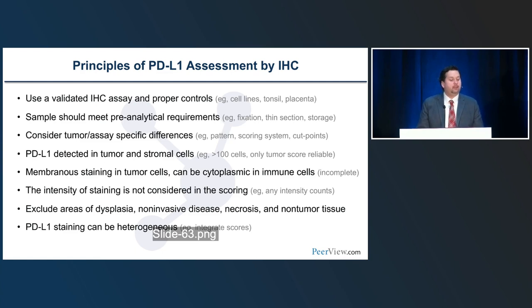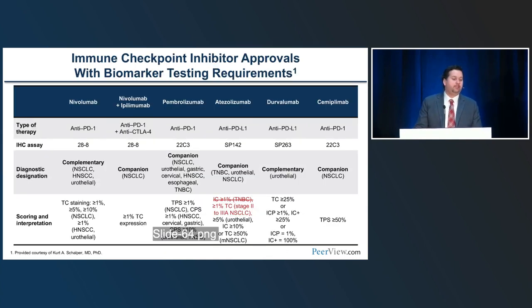And finally, PD-L1 staining can be heterogeneous, and we see that particularly in certain tumor types. And the current answer to that problem is to integrate the scores from multiple different areas rather than using a hotspot approach where we just score the highest. So these are the major principles that guide PD-L1 assessment.